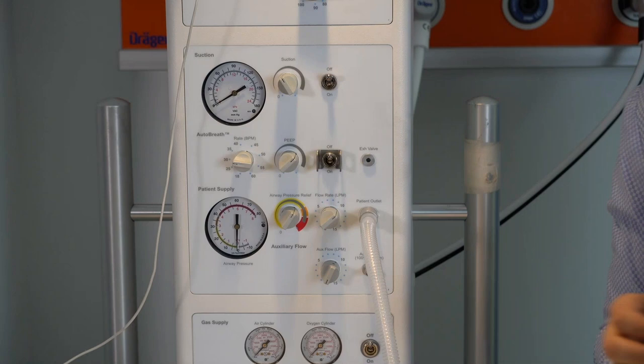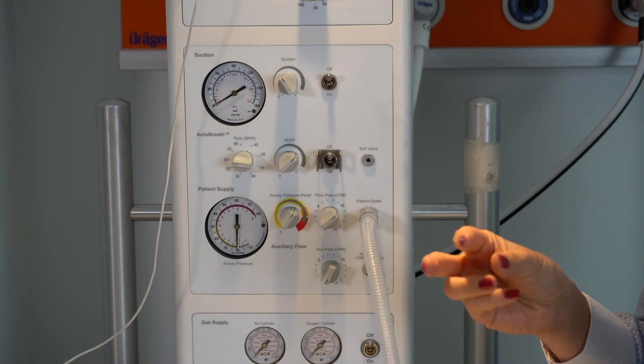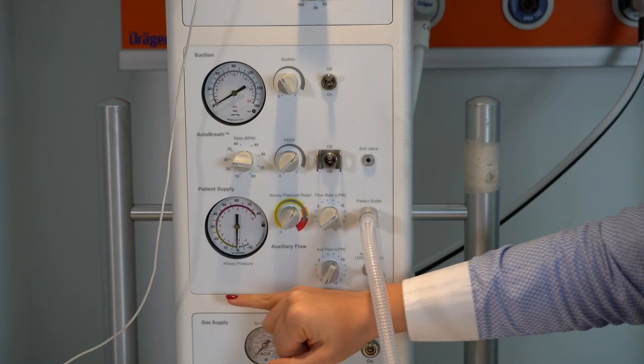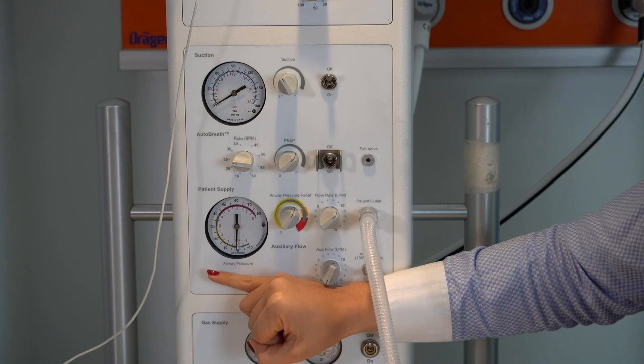And I think this is very important, especially in comparison to the ambu bag resuscitation, because what Linda was referring, especially with very active movement of the finger, that first of all, we have no way to monitor the delivered pressure on the ambu bag. And that's why we have to be very careful when we perform the resuscitation with the ambu bag. With the resuscitator, you are able to see the pressures that are being delivered to the patient. So you can observe and adjust based on the patient conditions.